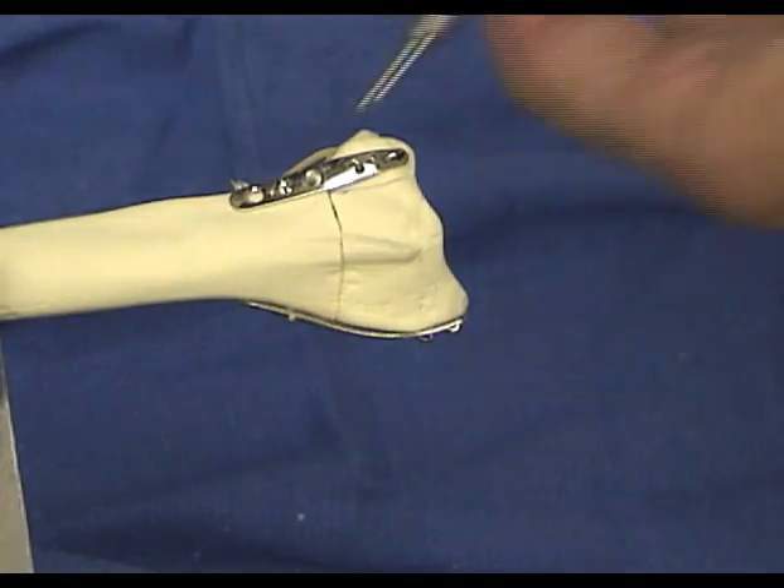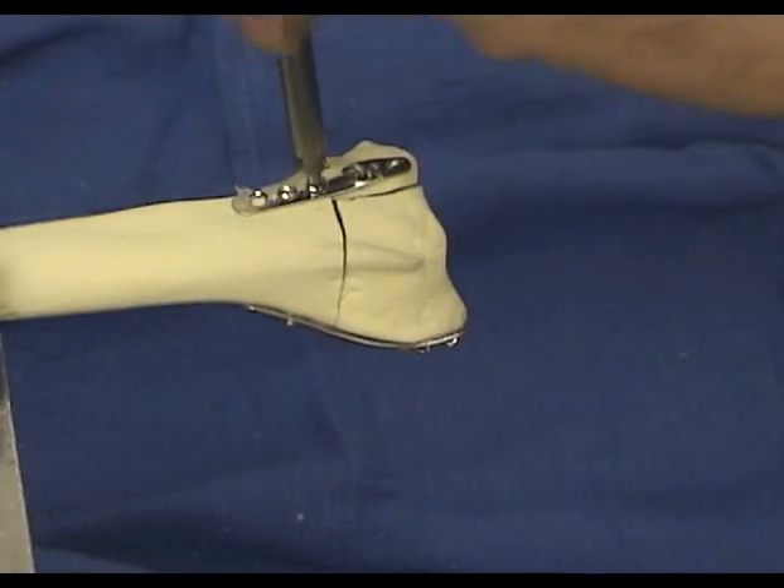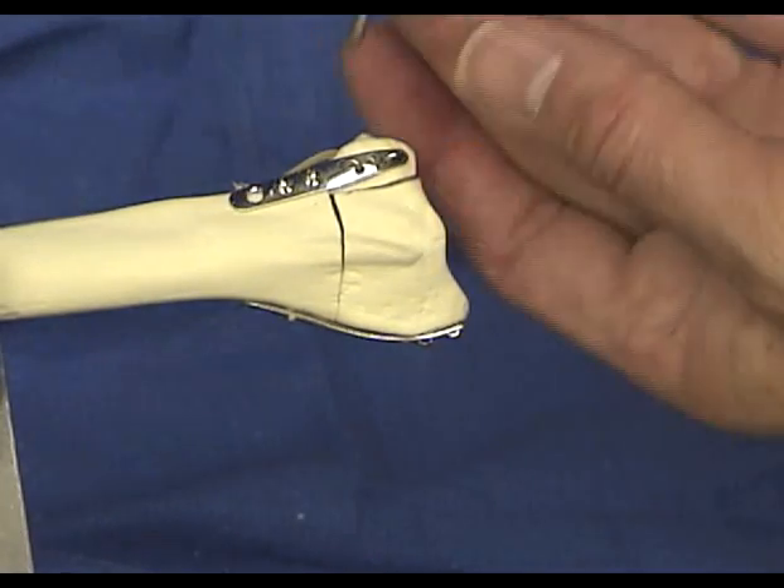If the pins from the ulnar pin plate were incorrectly measured and are too long, a limited volar exposure allows the protruding ends to be cut.